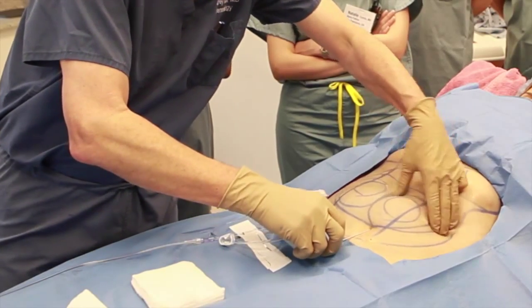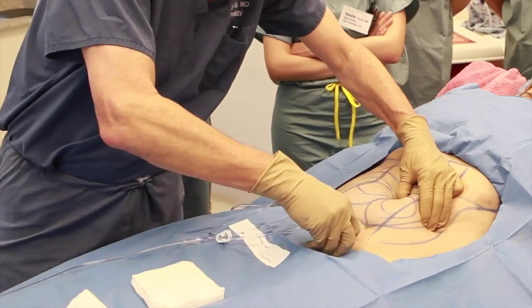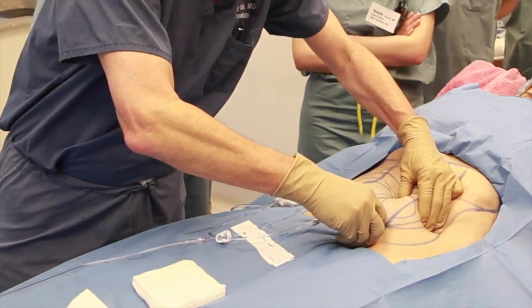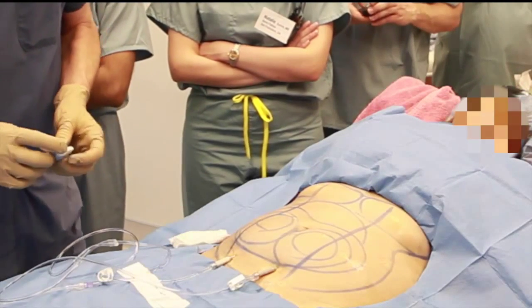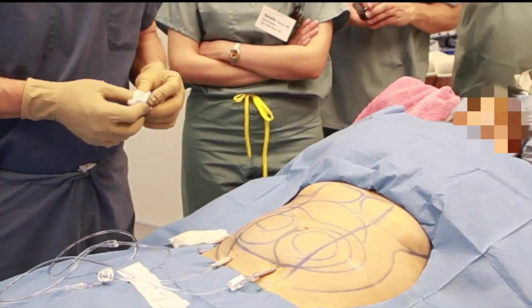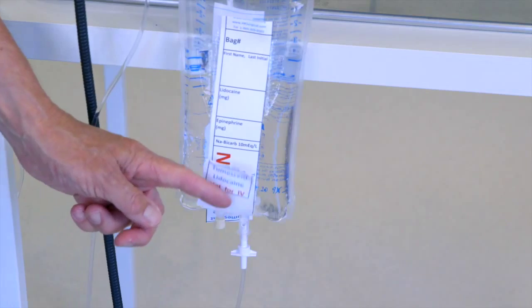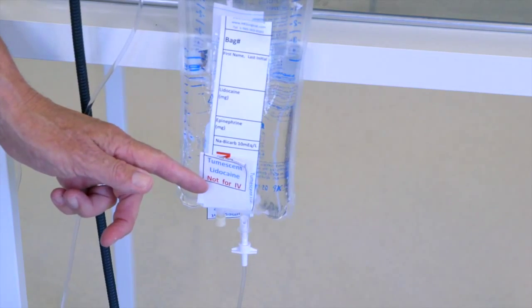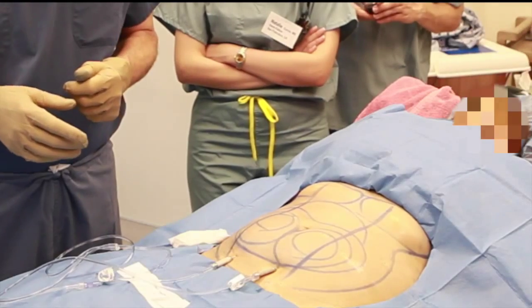We're going to use two cannulas at the same time for this relatively large abdomen, in anticipation of doing liposuction totally by local anesthesia. Now we're placing the two full Monty cannulas. We use labeling on the bags of tumescent lidocaine anesthesia to assure that there's been no accidental or inadvertent infiltration by IV infusion.